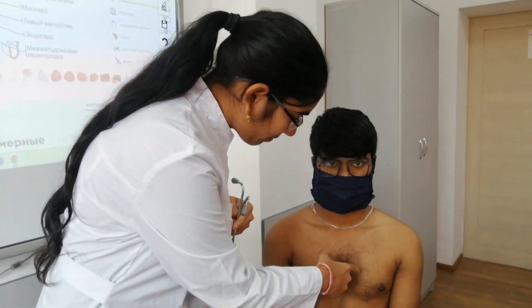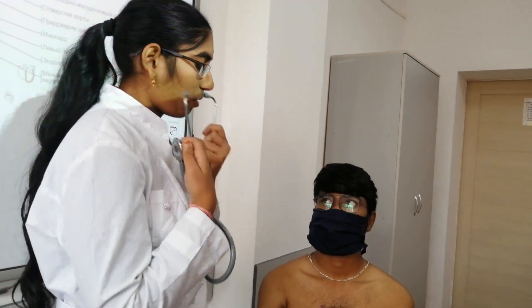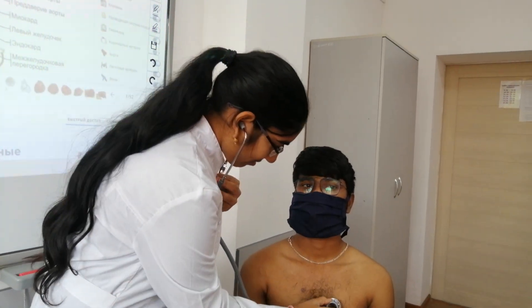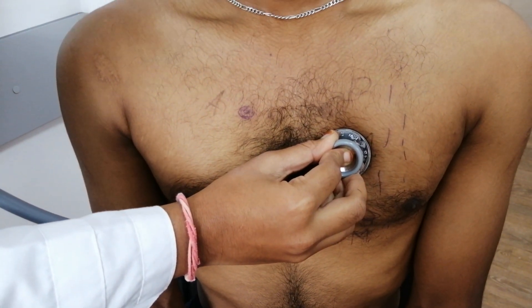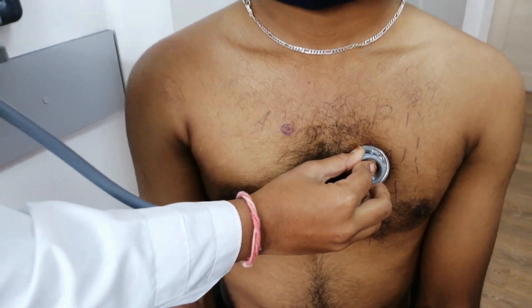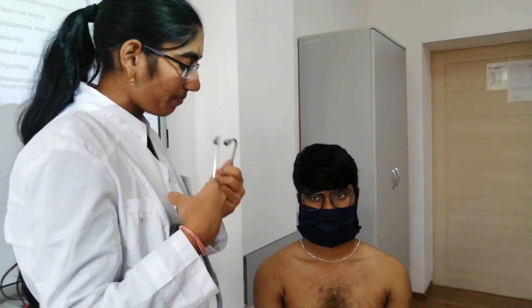Next point name. Second intercostal — no, third intercostal. This is not the aortic valve point. We are identifying the Botkin-Erb point: third intercostal space, left sternal border. Listening.